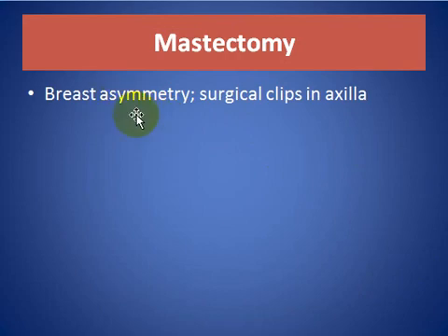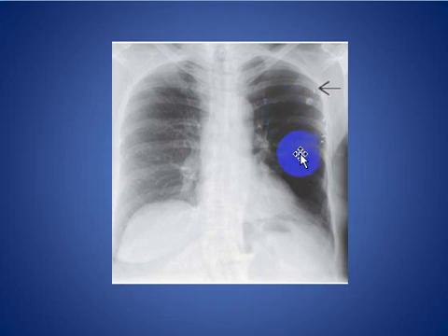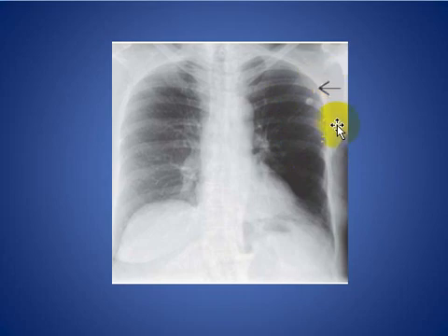For mastectomy: breast asymmetry and surgical clips in the axilla are clue signs for the history of mastectomy. As we see here, on the left side there is a hyperlucent left hemithorax with surgical clips in the left axilla, indicative of prior left mastectomy.